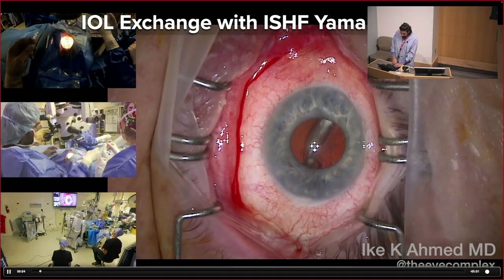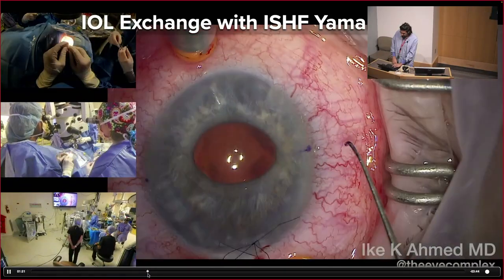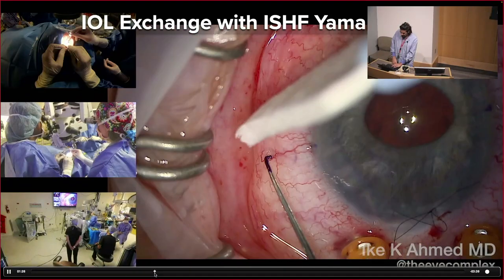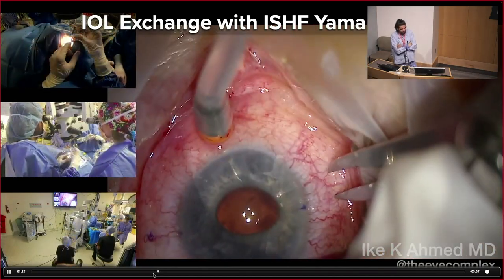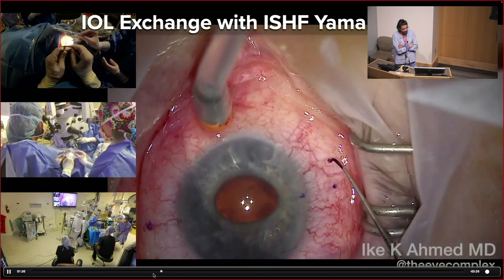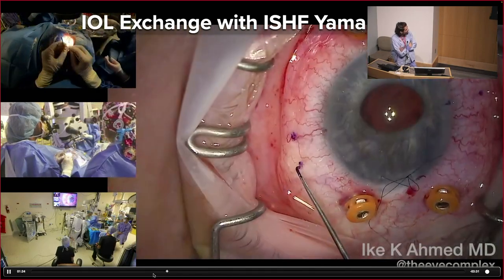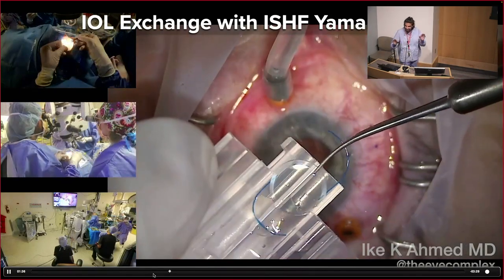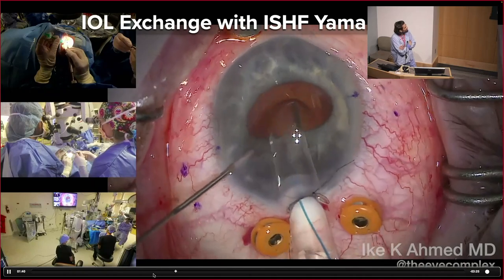Just one little tip that I will say is probably the hardest part in this is the IOL exchange. The hardest part, and by the way, one thing is the fellows on this, I'm very particular about marking. I really think we need to be very refined with our marks, make sure we really take the time to position them well, make them nice and clean. As Alan always said, the video has to look nice. We don't want messy marks everywhere and difficult to see.